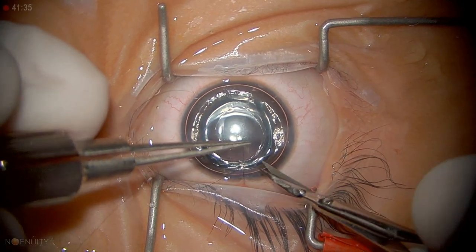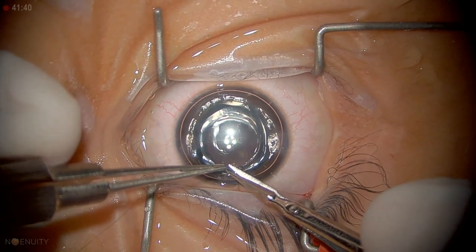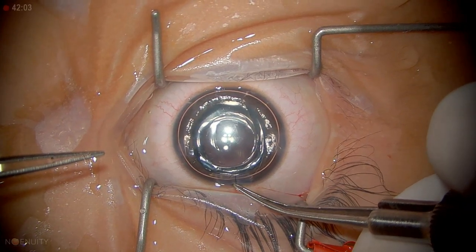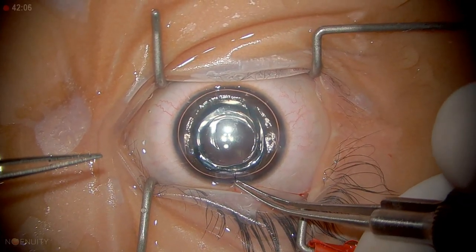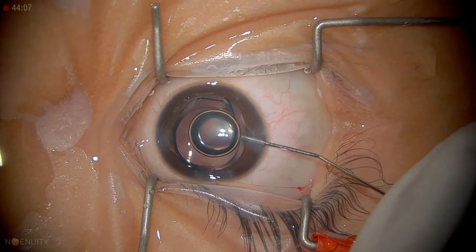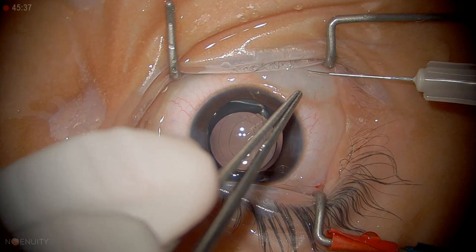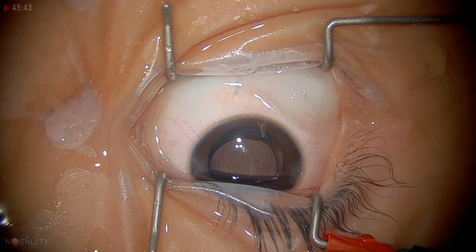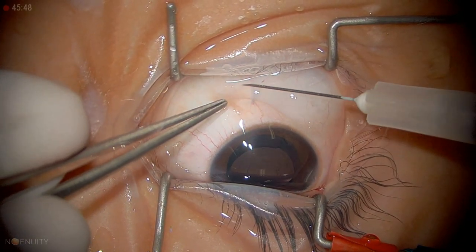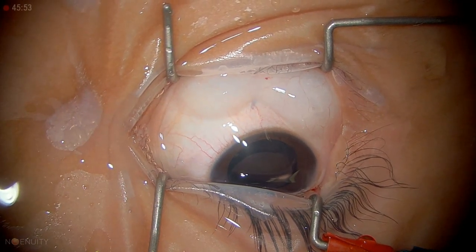Before closing, in pediatric cataract surgery, just make sure it's not leaking — you have to see for yourself that everything is fine. If in doubt, always take a suture. It is extremely important that you bury the suture and take out the air bubble. Give an injection either intracamerally or subconjunctivally — I usually give Vigamox and steroid. This is important because the child may not allow eye drops in the immediate post-op period; at least for 24 hours you have some steroid and antibiotic as protection, especially for the first day.